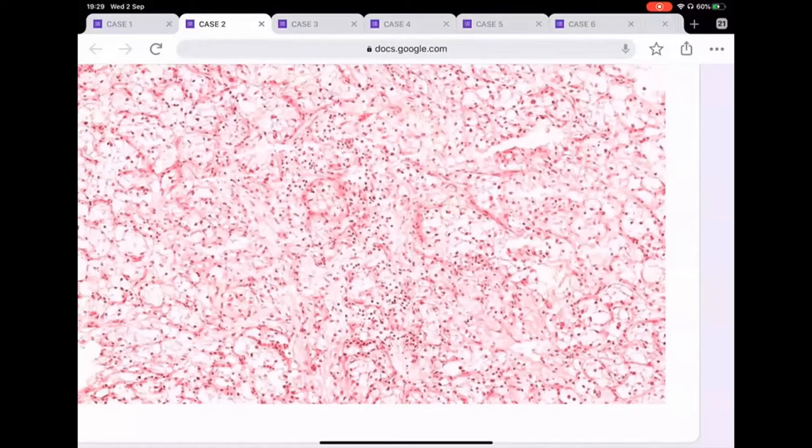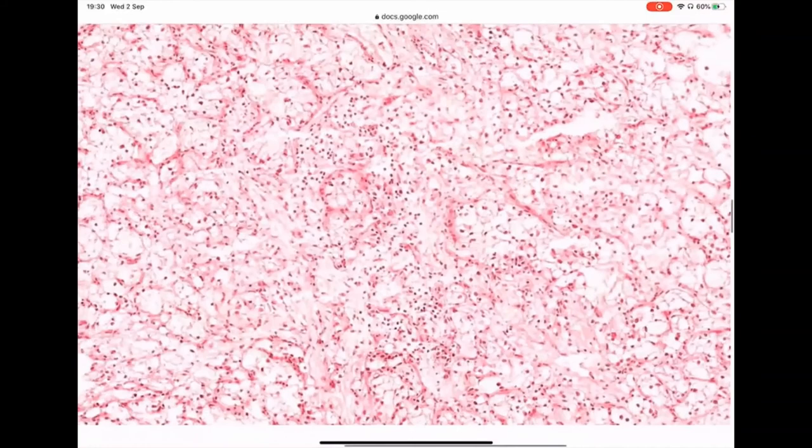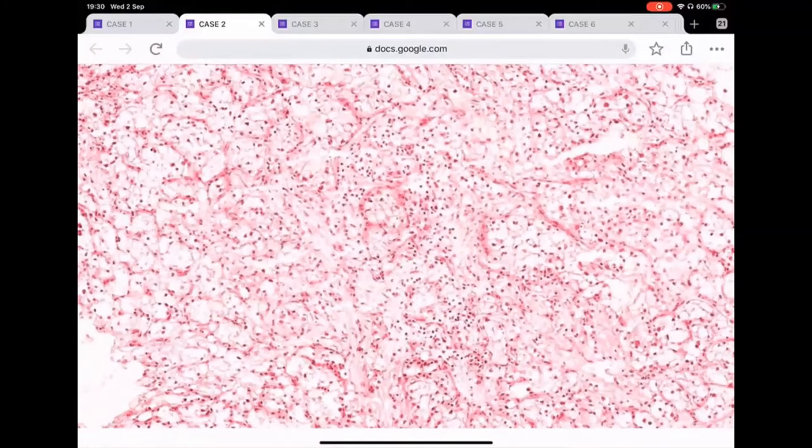This is not what the surgeon is asking you, okay? To get an adrenal rest situation in the exam, you will either get it on a different organ in a completely abnormal site, like on the testis or on the surface of a spleen or something like this, or even a small nodule in the peritoneum. But you wouldn't get it in this scenario. So for this scenario, please don't apply your clear cell template. It is not the case for this clear cell template, okay?